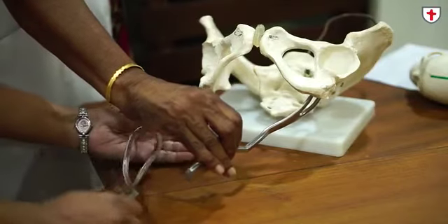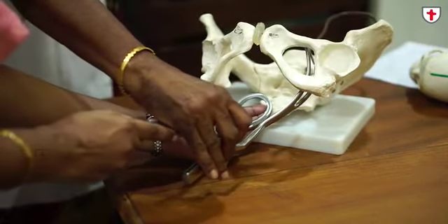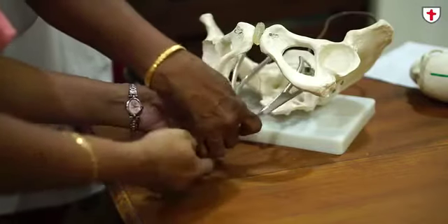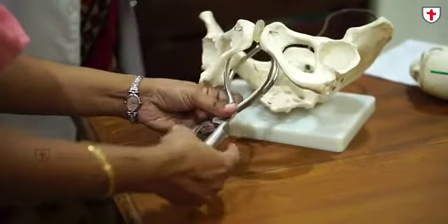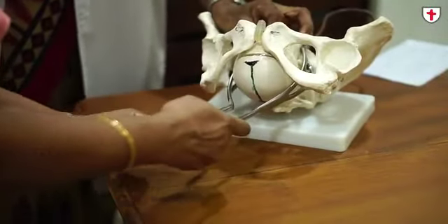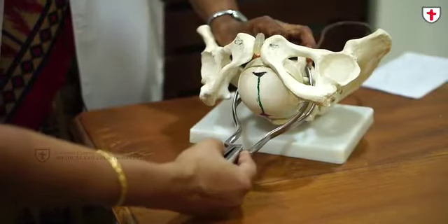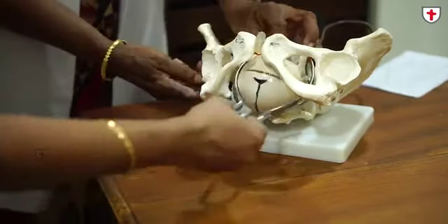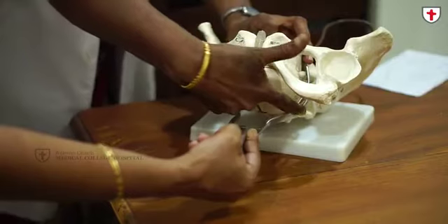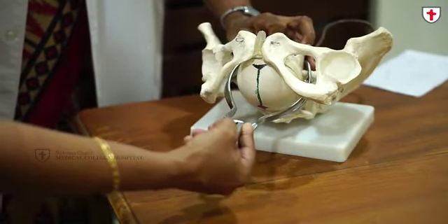The right blade is taken in the right hand and two fingers of the left hand are kept in the right posterior quadrant of the pelvis. It is gently swept to the right side of the pelvis. Once it is a proper application, there will be no difficulty in locking the instrument. Once properly applied, the sagittal suture is in the AP diameter of the outlet. The two blades catch hold of the two parietal bones, and in outlet forceps, you can see only the tips of the blades at the sides. The posterior fontanelle will be just below the pubic symphysis.